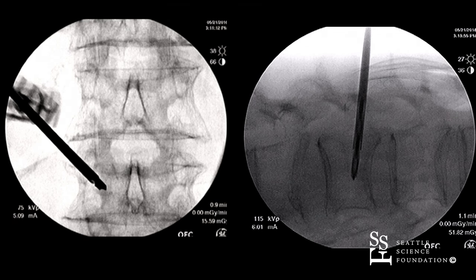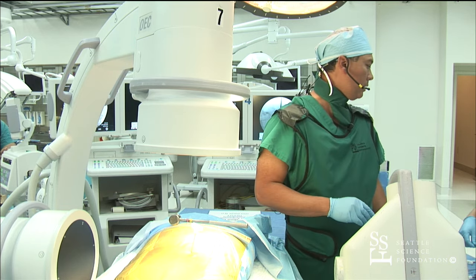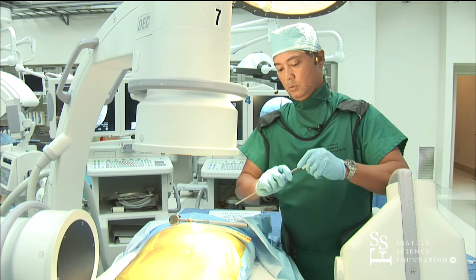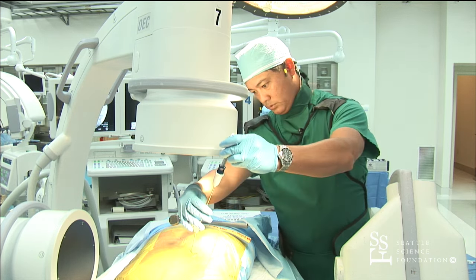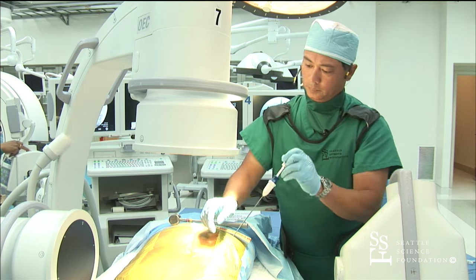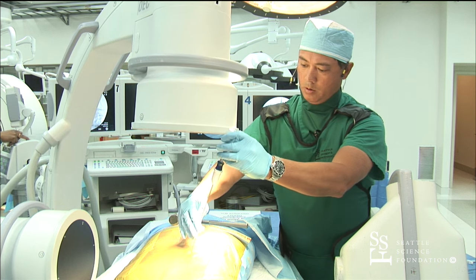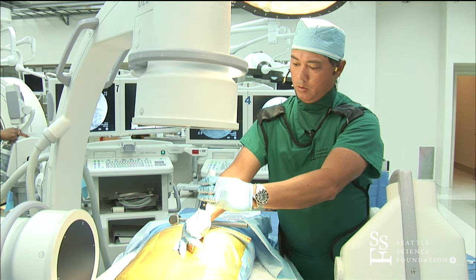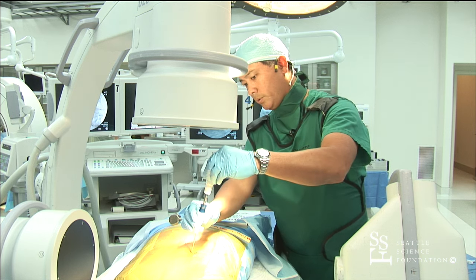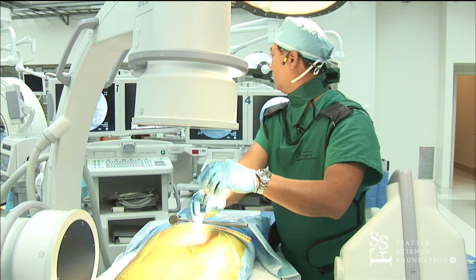We didn't get as far medial as we would like to. We also have a nitinol articulating device that allows one to get across the vertebral body.